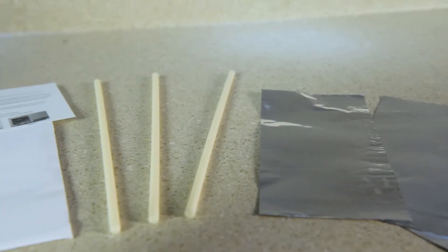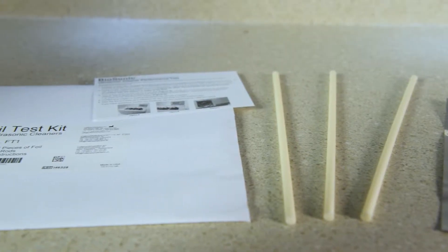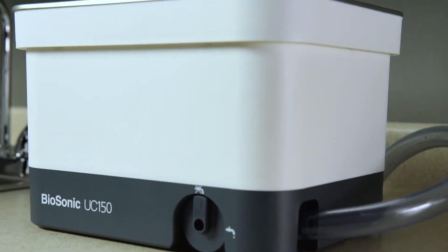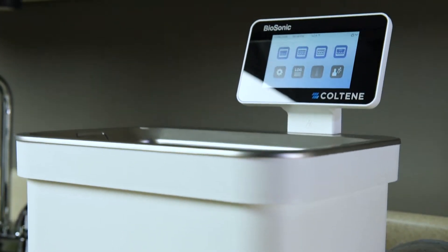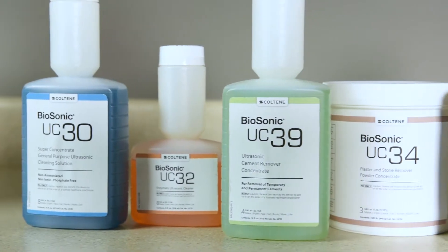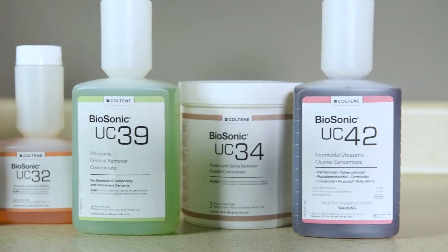To check the effectiveness of your Biosonic UC150, you should perform intermittent foil tests. To perform a foil test, you'll need your Biosonic UC150, Foil Test Kit FT1, and any Biosonic solution or other solution.